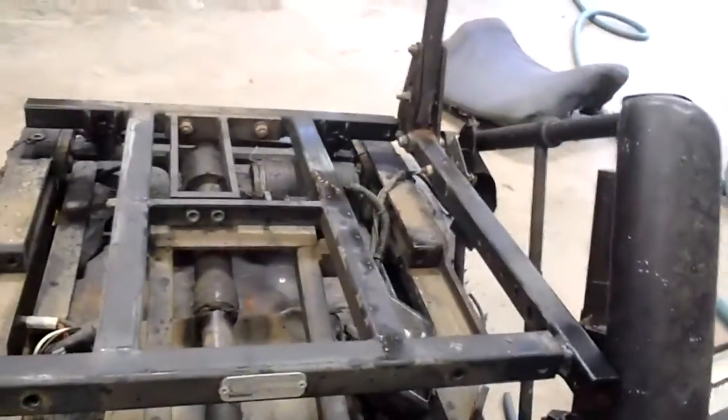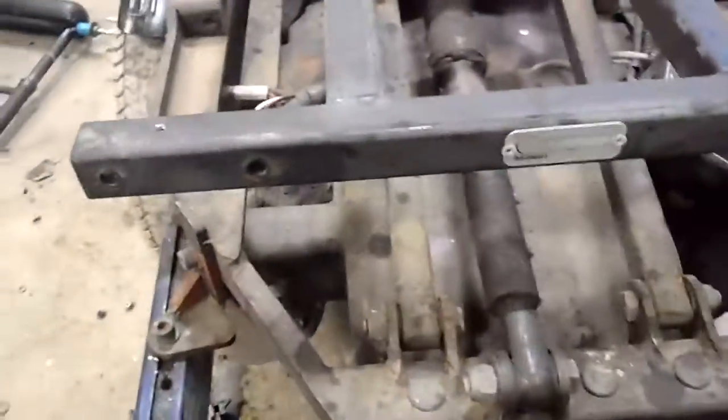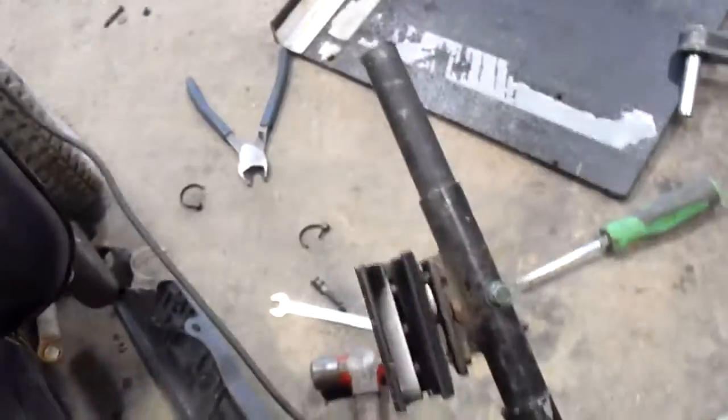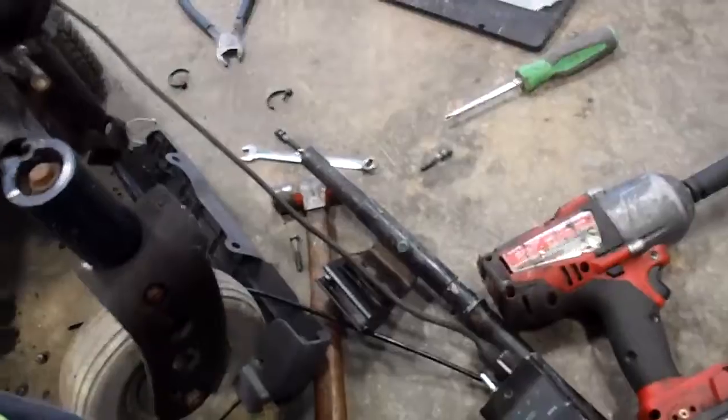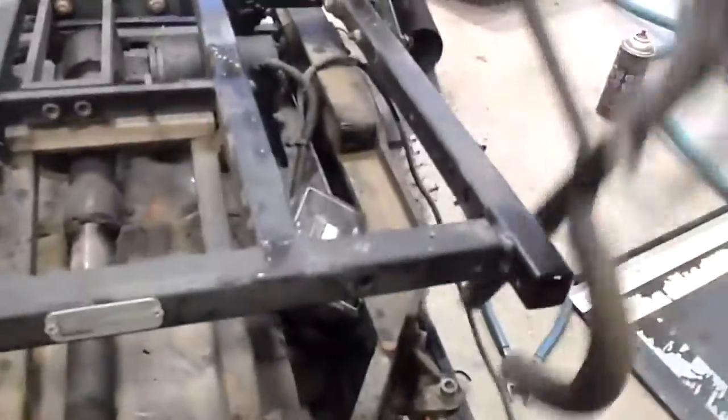I'm gonna take this right out. There we go. Knock that off. Gonna knock this side off. I'm just gonna make sure that my electric control, oops, it's turned on, is not going to get damaged. It just has a little pinch clamp like that, and it goes onto one of these bars. So I'm going to be probably reusing that stuff, cleaning it up though. I'm going to be touching up the paint and everything on this thing.